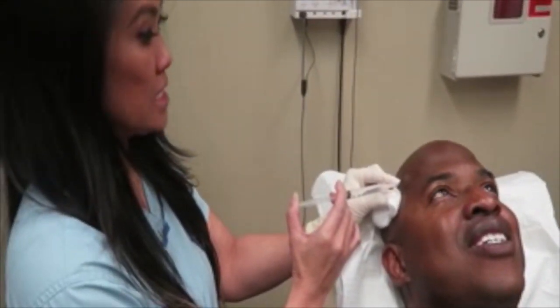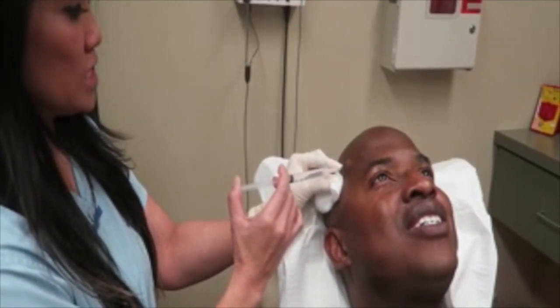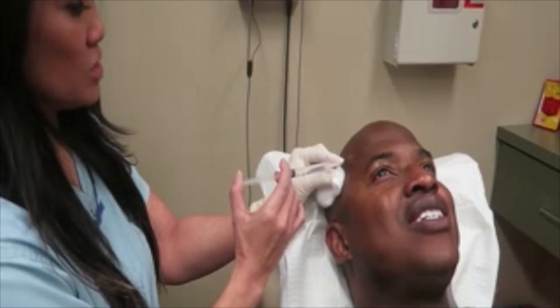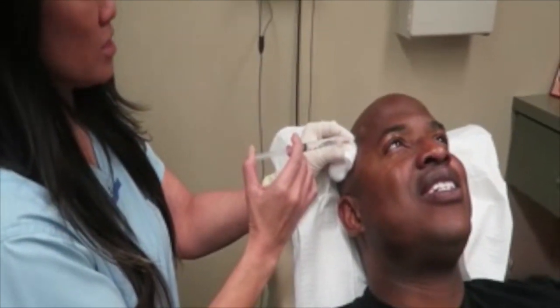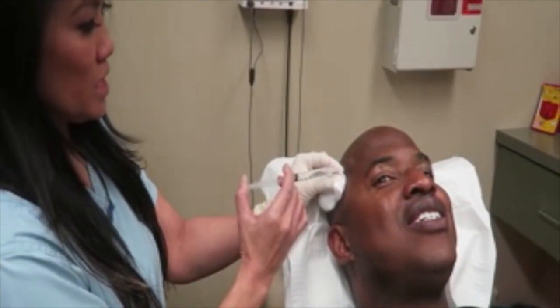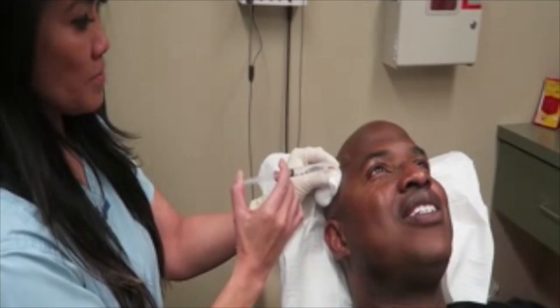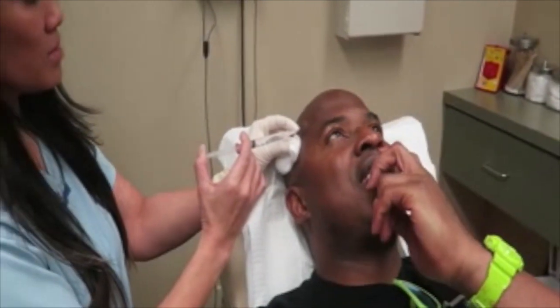So what I actually do here is when I put numbing, I let it sit and I just poke with the needle, because actually it hurts when you just poke. After that, you don't really feel it under the skin. If I don't inject it really fast, we usually don't feel it. So if I just sit there for a little while and do it slowly and then start to increase the numbing slowly, it's actually much more comfortable. We're all about comfort in dermatology because most of my patients are awake.